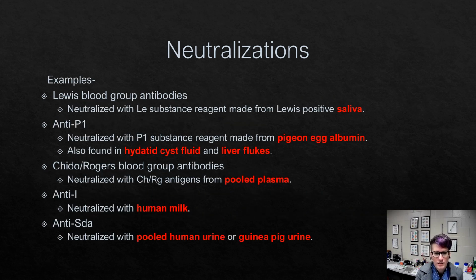So these are some examples. Notice these are mostly antibodies that are not clinically significant, and they're kind of just nuisances. So you can neutralize these so that you can continue and rule out all your clinically significant antibodies.